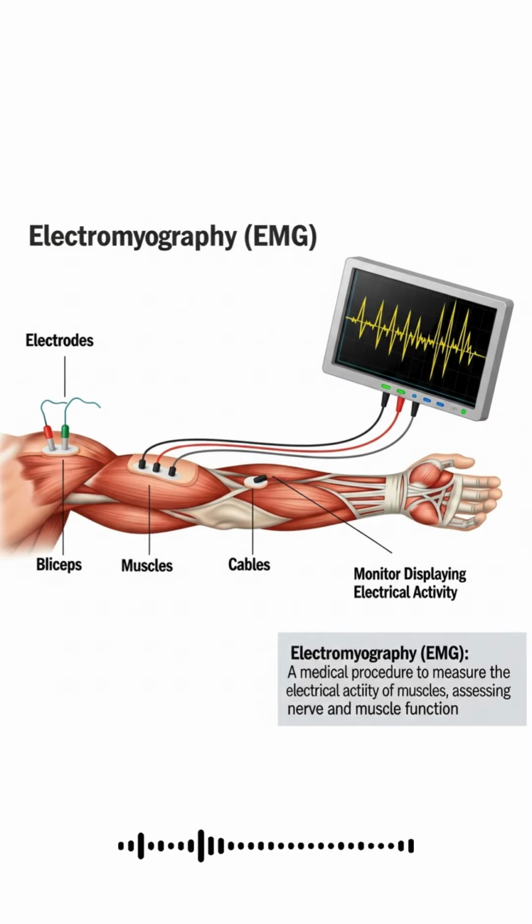By using EMG, we're not just measuring how fast someone moves, but we're also learning how their body responds to signals and controls movements. This is useful during things like sports, physical therapy, and even research. For athletes and coaches, EMG can show whether the right muscles are being used during a specific movement. And in physical therapy, it helps doctors see if the muscles are recovering and working together. And even when it comes to researchers, EMG helps them understand how the brain and muscles are going to work together to control the body.